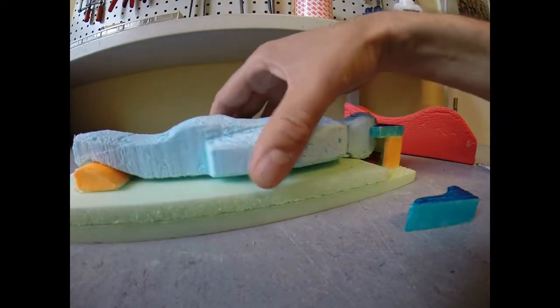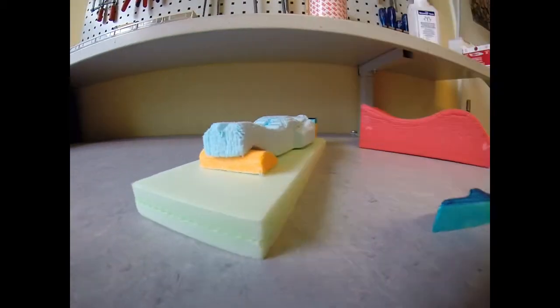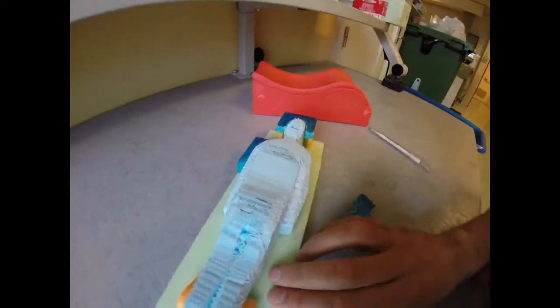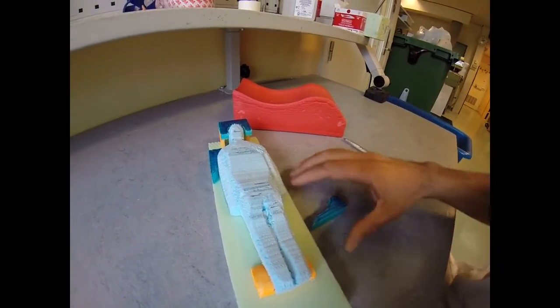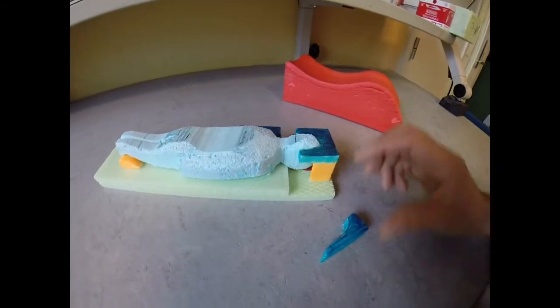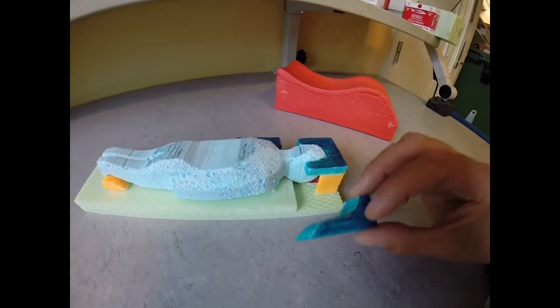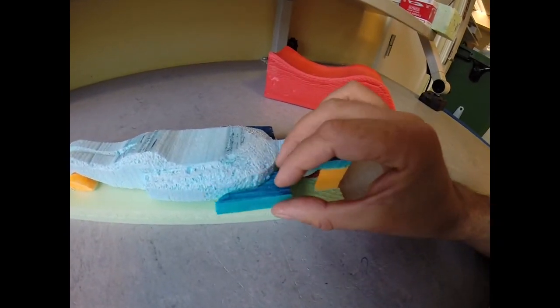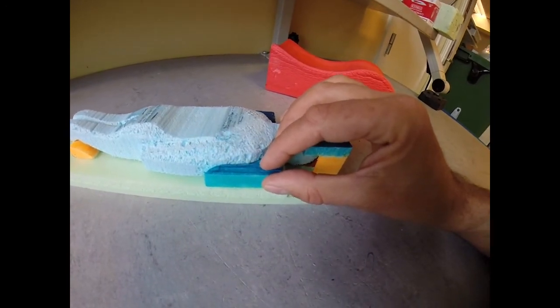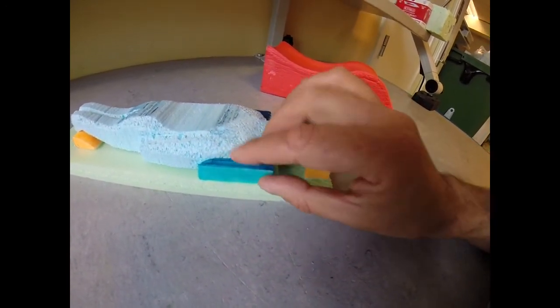So they will put the patient on there in a straight line. Then they would take the polystyrene shoulder part and they would hold it against the patient and then they would glue it to the polystyrene base.